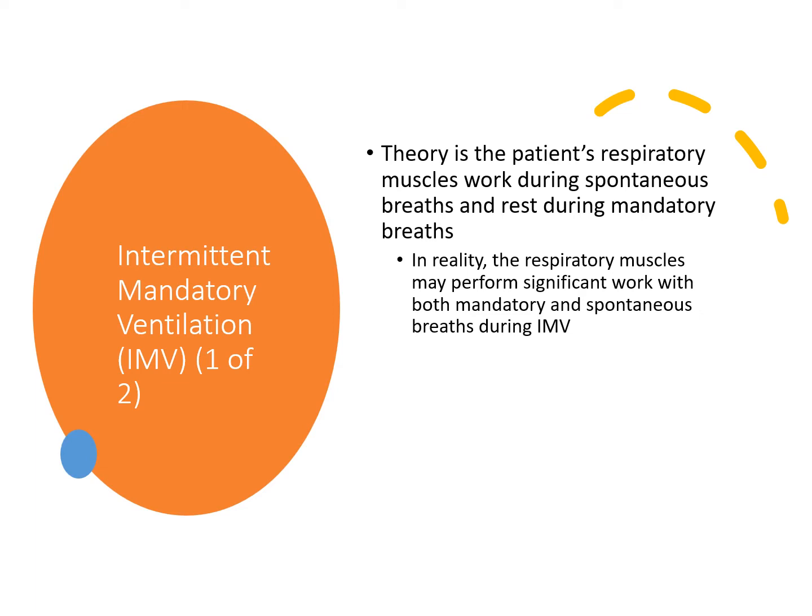The idea there is to prevent excess fatigue, and then also to avoid atrophy, as one of the other thought processes with using this mode that shares that work of breathing, and to avoid any type of atrophy on the ventilator.